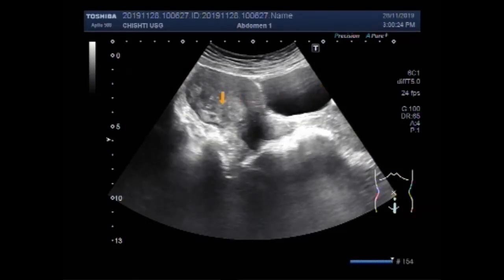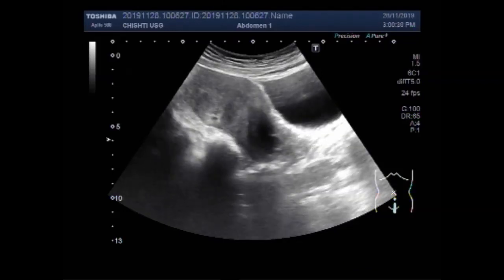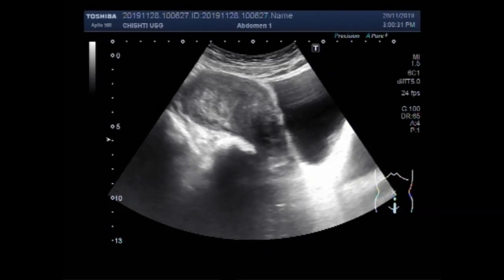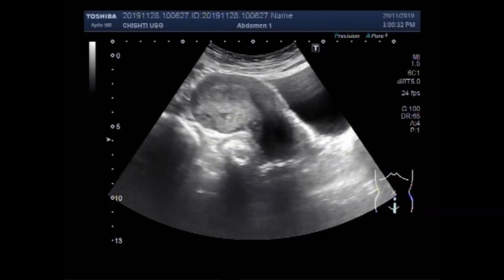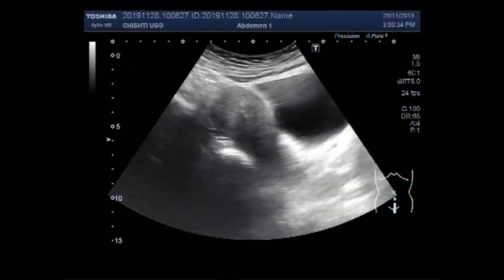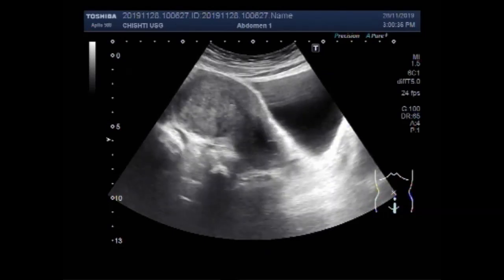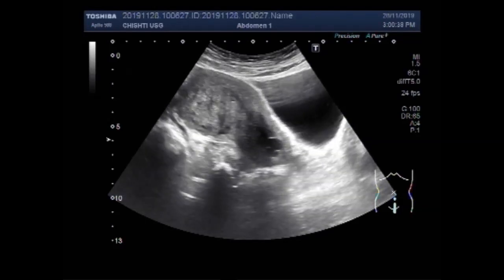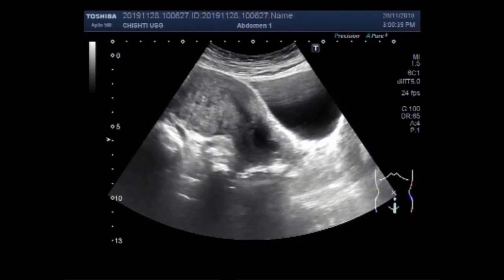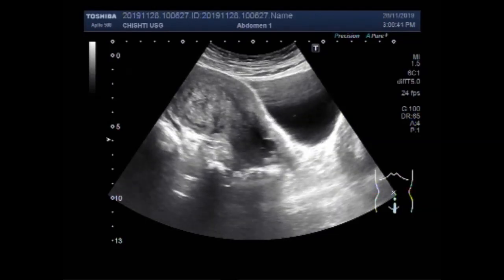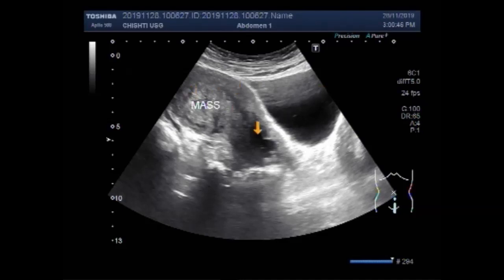By using proper probe technique you can get the best view of the mass. Now you can see a better view of this mass. This is the mass, and this one is a cervical cyst.